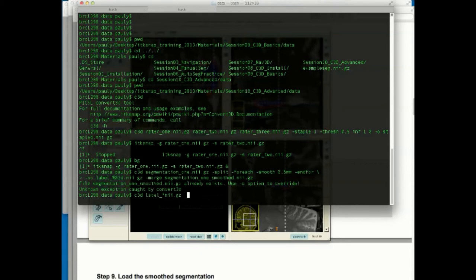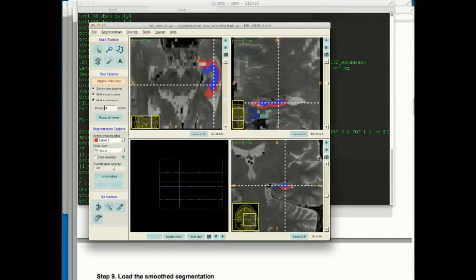So it's going to load all of those images, and then you are going to vote. It's basically going to do the same thing as merge did. But there is one crucial difference. Okay, so now we have voted and we have the recombined segmentations.